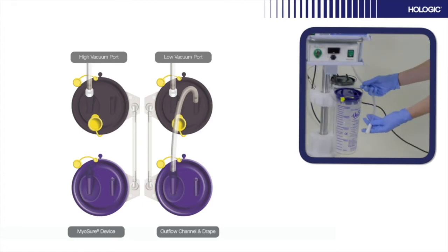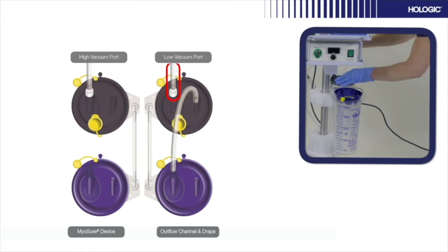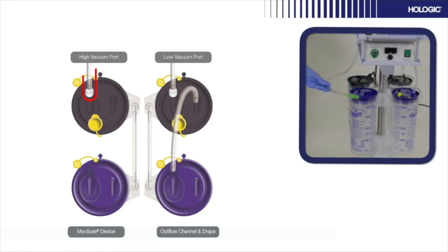Then ensure the back black canister is connected to the low vacuum source by attaching the reusable vacuum tubing as shown. Repeat the same setup on the left side by ensuring the high reusable vacuum tubing is connected to the back black canister from the pump. Then ensure the reusable vacuum tubing is connected in the middle of the canisters.